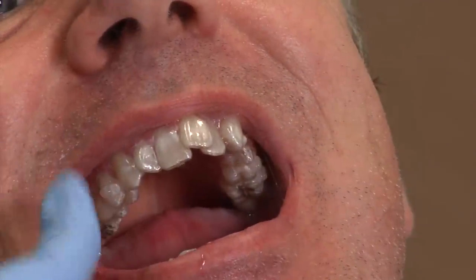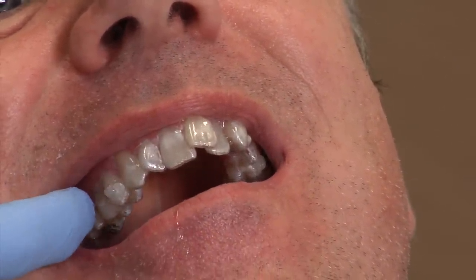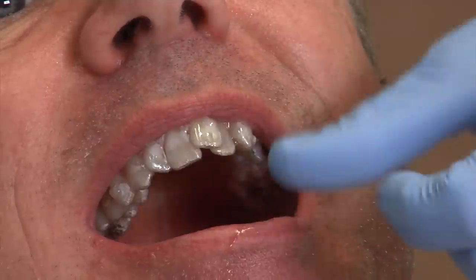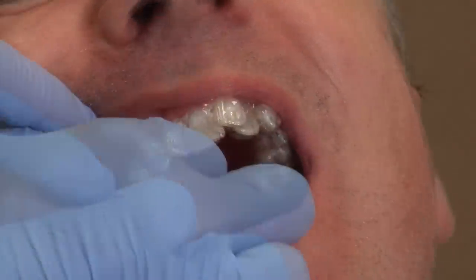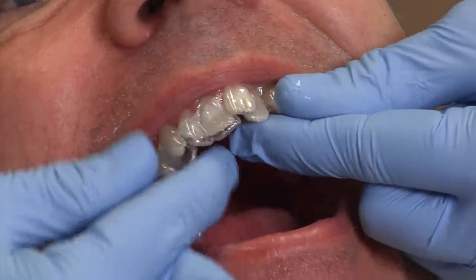For the top aligner, we're going to remove it the same way. If you find that you have a lot of attachments on the outside of the back teeth, it might be easier to take your finger and remove the aligner from the inside back, then just work your way around. Always go from the back first, then work your way around.